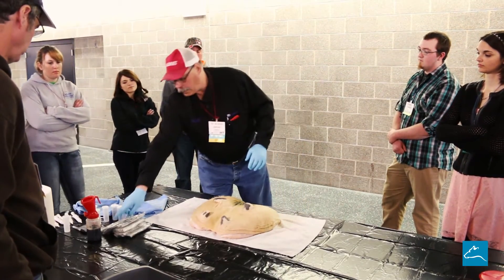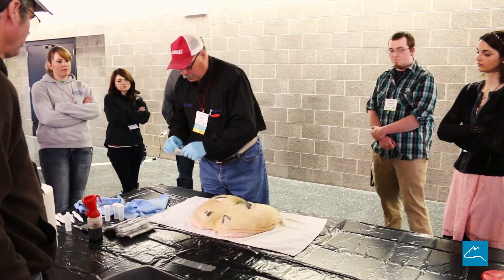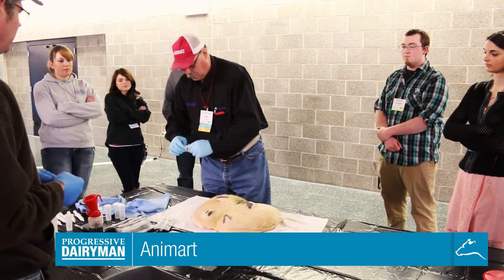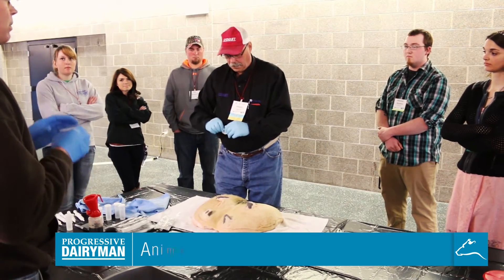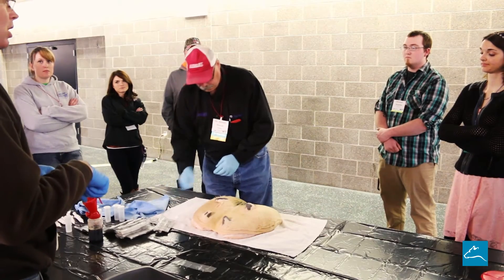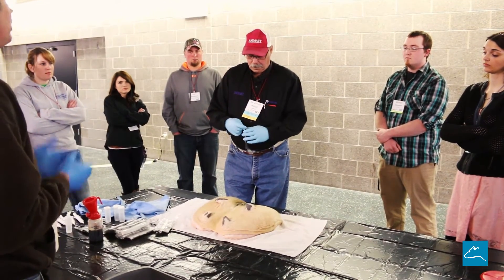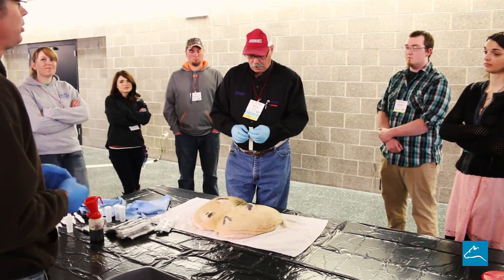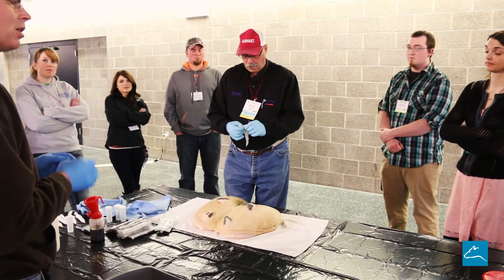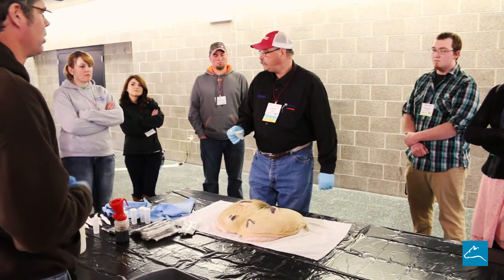We're going to go in and take an alcohol pad. These are the little squares that come in your mastitis tube or dry treatment. If you can get some 4x4s — like medical size 4x4s — put them in a Tupperware and put alcohol in those. You can get them, it's even better. You just don't want them soaking wet with alcohol; wring them out a little bit. You have a lot more surface area to scrub the teat end with those.